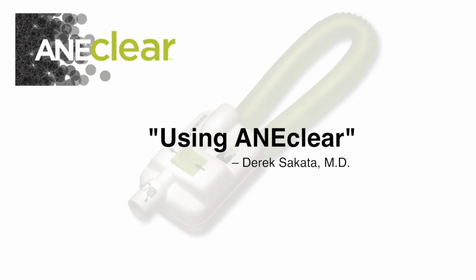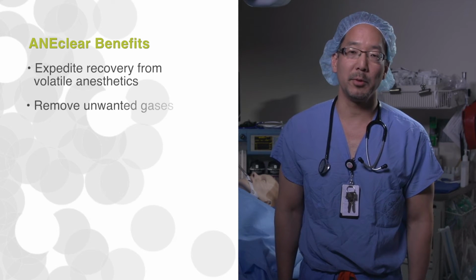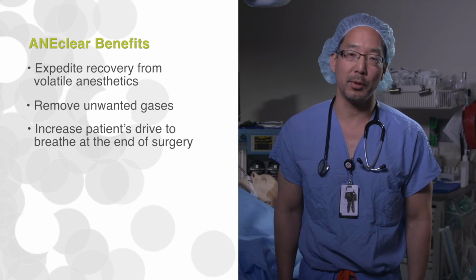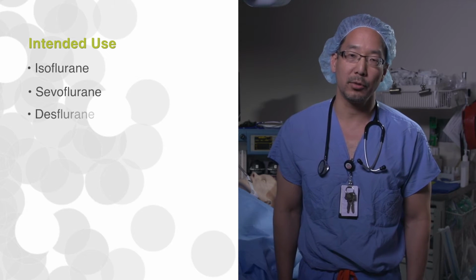We understand that while no technology can replace what you do, we believe our scientific advancements may help. The ANEclear anesthesia recovery device is intended to expedite recovery from the effects of volatile inhaled anesthetics by removing these unwanted gases and to increase your patient's spontaneous drive to breathe at the end of surgery. It is intended for use with only isoflurane, sevoflurane, and desflurane.